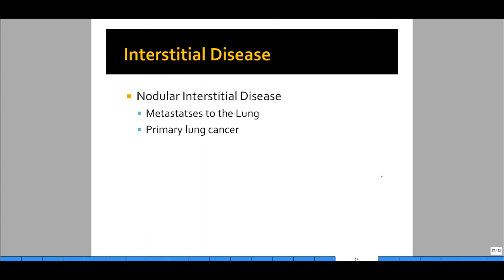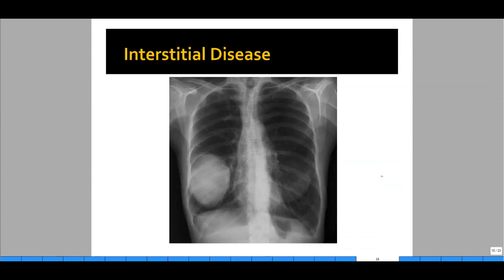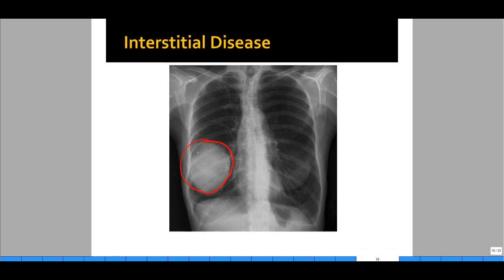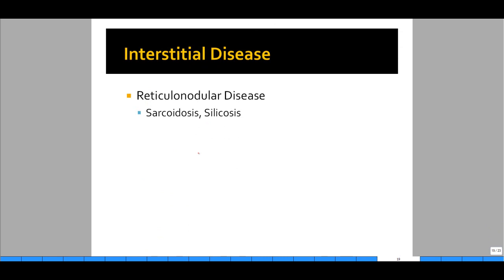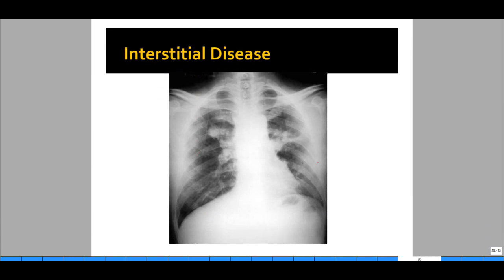Next, nodular interstitial disease — usually represented by metastases to the lung or primary lung cancer. It is very easy to identify: you can clearly see a large mass in the right lung representing a likely metastasis. Cavitary lesions can also cause these same findings. Reticular-nodular interstitial diseases tend to be caused by sarcoidosis and silicosis. These generally start off nodular and then, as they progress, become more reticular in appearance — sarcoid nodular areas are present with mediastinal lymph nodes, and then reticular appearance develops as the remaining lung tissue becomes fibrosed with collagen.